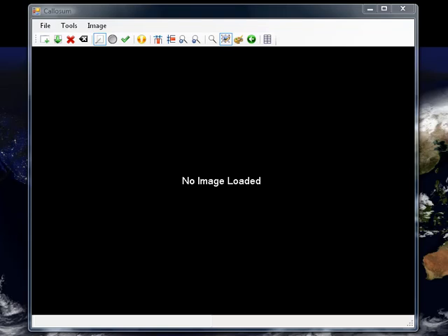In this video, I'm going to demonstrate the use of the Corpus Callosum program. So what we see here is the main window as it appears just after the program has been loaded. The first step in performing analysis is to load an image.